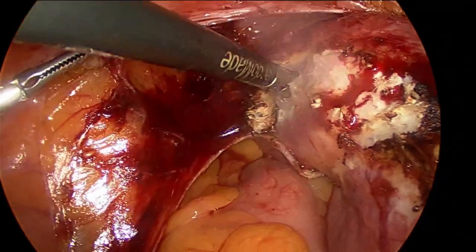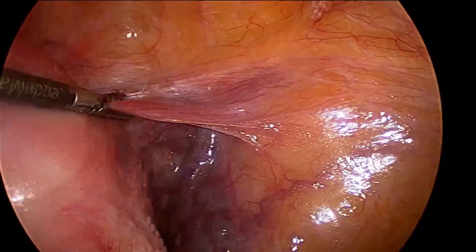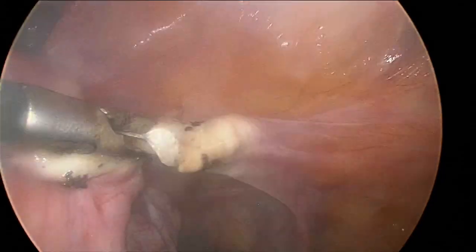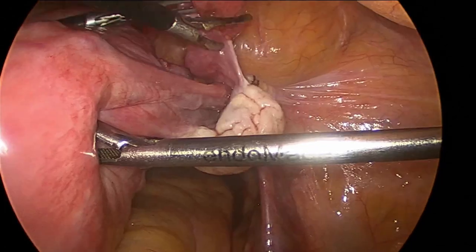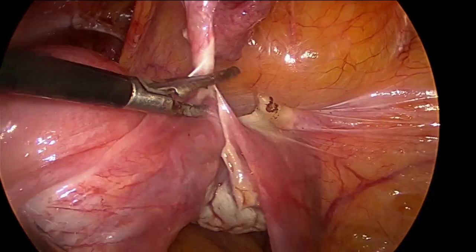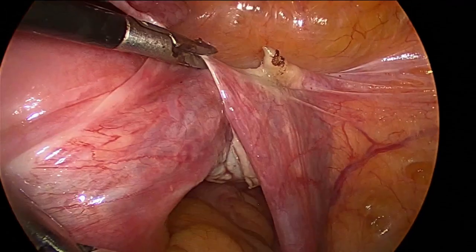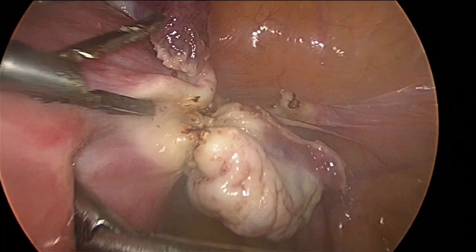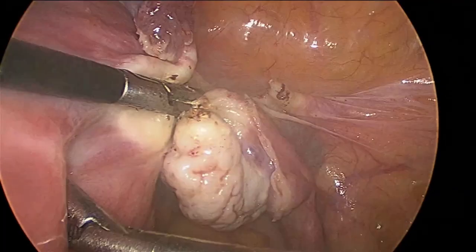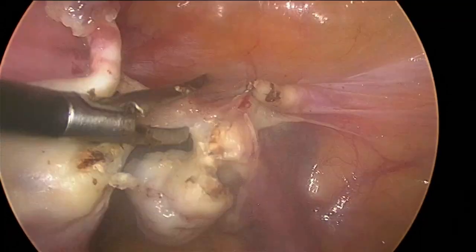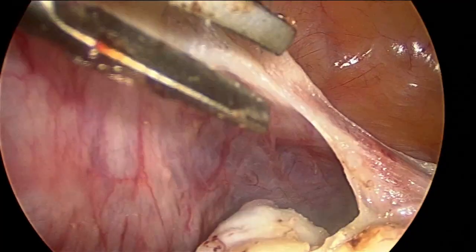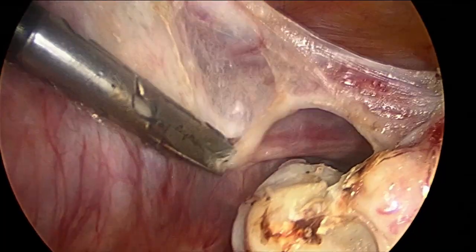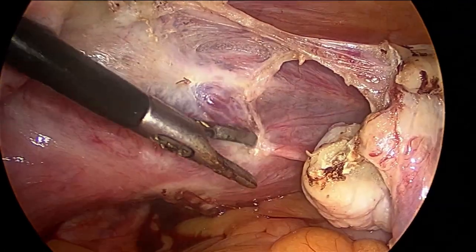Now the dissection was proceeded towards the right side. First, the round ligament was well coagulated and cut with the help of bipolar shears, then the tubo-ovarian ligament was taken care of, keeping the dissection near the fallopian tubes. The ovarian ligament was well coagulated and cut, and the ovary was released away from the uterus. Then the posterior surface of the broad ligament was dissected deep till the level of the uterosacral ligament.